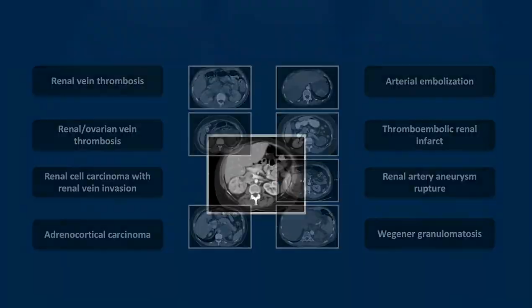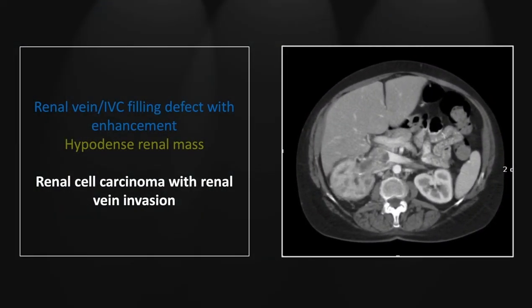Our next case is a renal cell carcinoma with renal vein invasion. Of course, the renal cell carcinoma is one of those classically angioinvasive tumors. You can see the filling defect here extending from the right renal vein into the IVC, and note specifically the contrast enhancement within that otherwise hypodense filling defect — pretty much classic appearance of tumor angioinvasion, clearly denoting a soft tissue component to that filling defect.